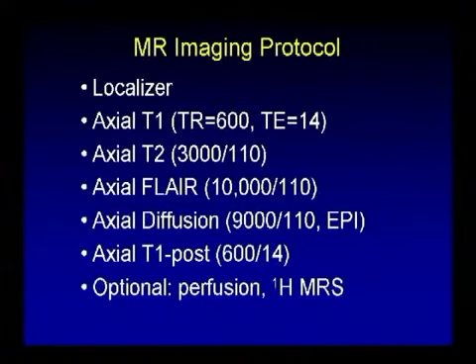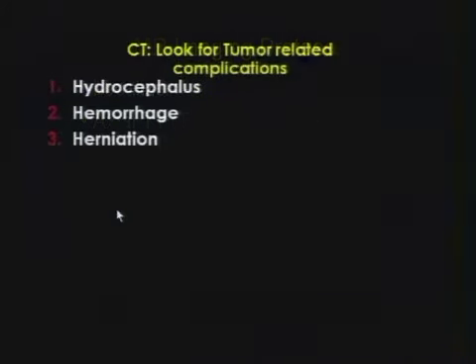And I listed in your syllabus a typical protocol that we use at UCSF. But I just want to focus. When you look at CT, look for 3 H's: hydrocephalus, hemorrhage, and herniation. CT is incredibly good for these 3.